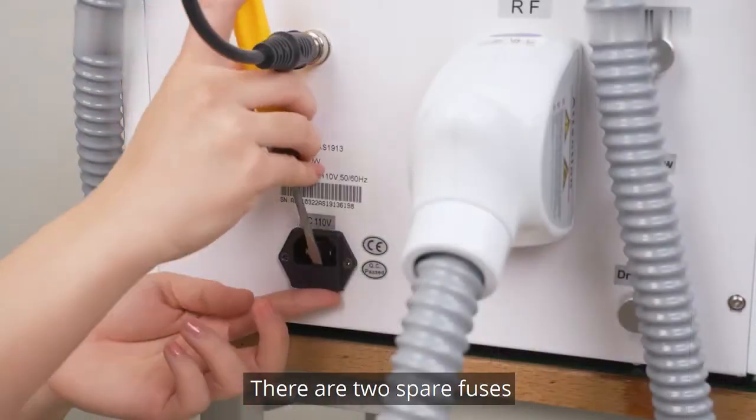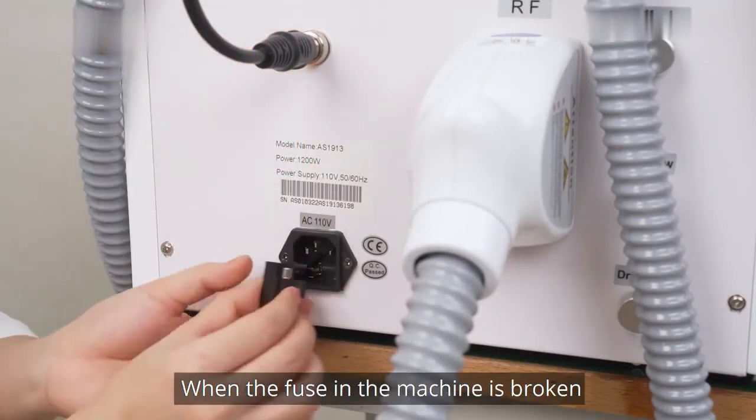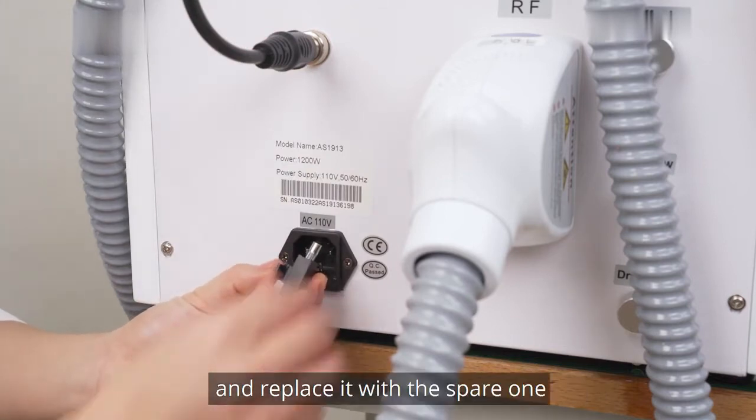There are two spare fuses which can replace a broken one in the machine. When the fuse in the machine is broken, use the screwdriver to take it out and replace it with the spare one.